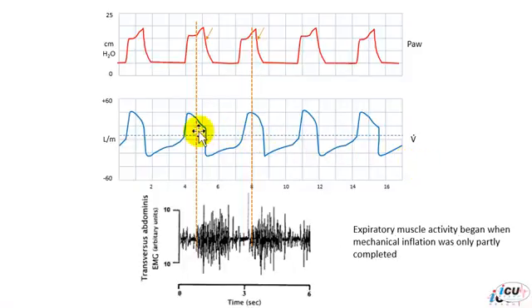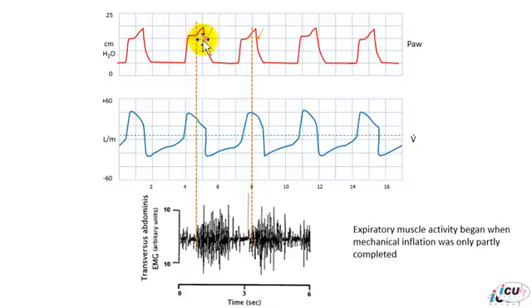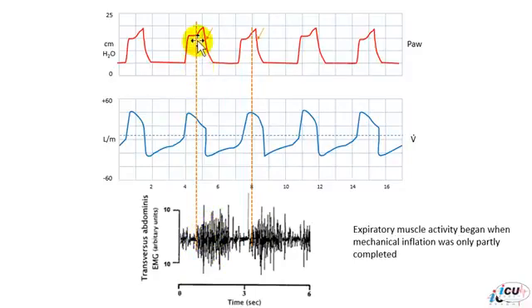In this example, the patient is on pressure control mode of ventilation. In pressure control mode, you set the inspiratory time on the ventilator, and the inspiratory time is finished at this point. However, you can see that the patient has a hump at the end of inspiration. When you relate this to the expiratory muscle activities, you can see that the patient activated his expiratory muscles, which caused the pressure to go up at the end of inspiration. So the patient terminated his inspiration; however, the ventilator inspiratory time is not finished yet. This is an example of early termination.